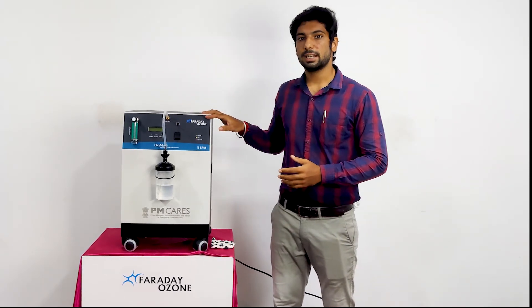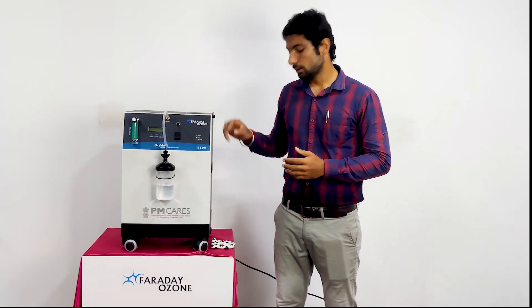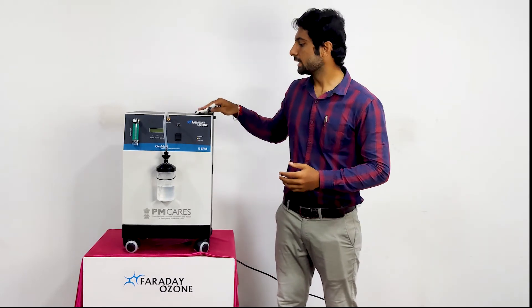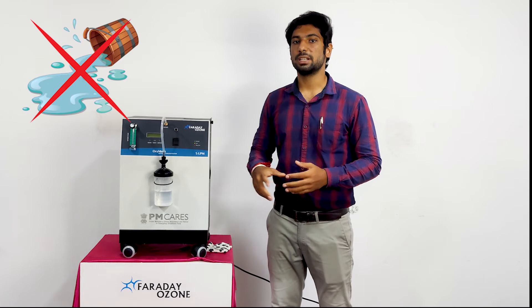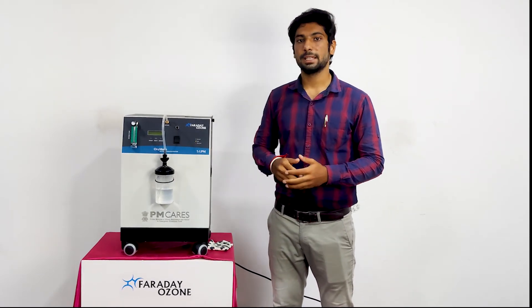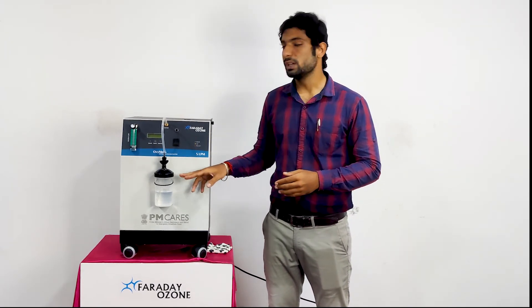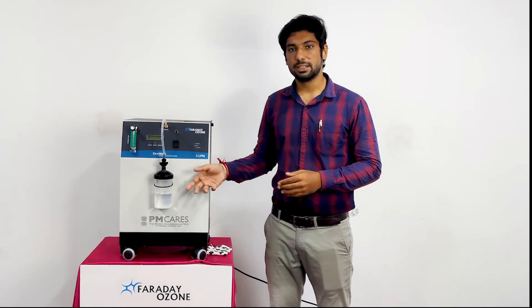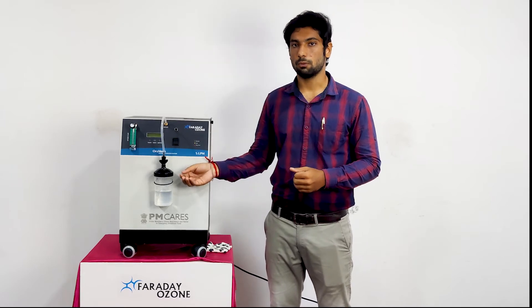Let us see the cleaning and maintenance part of this Oxygen Concentrator. Check the cabinet every month, and if there is any visible dirt, use a dry cloth to clean the surface. Do not use any solvents or spill any liquids over the surface. To clean the humidifier, change the humidifier water every single day, and weekly once, clean the humidifier bottle using detergent soap and warm water.